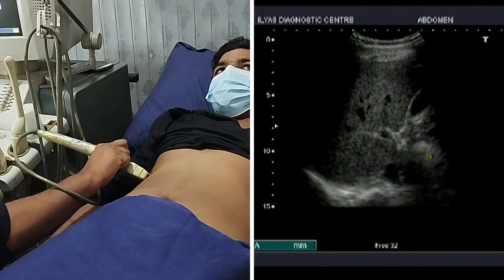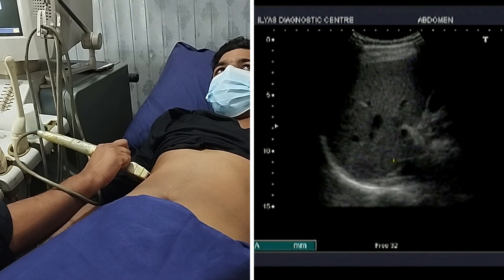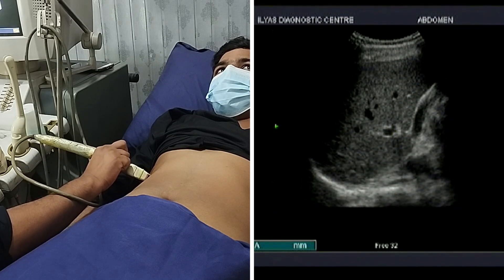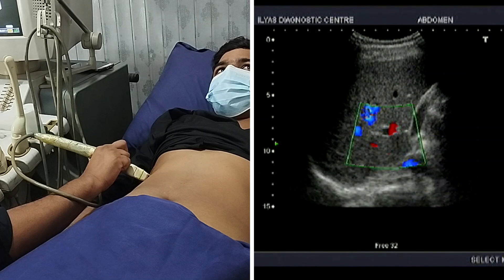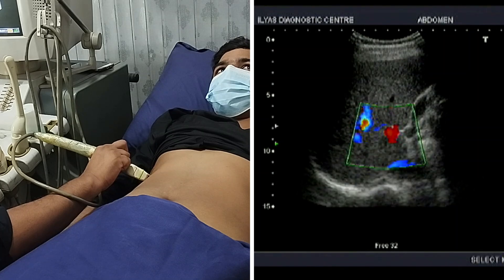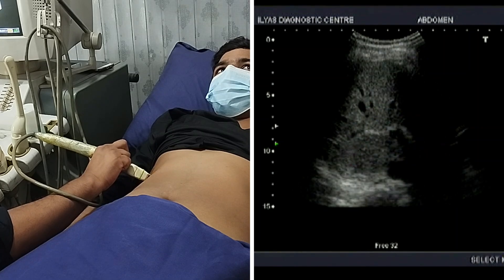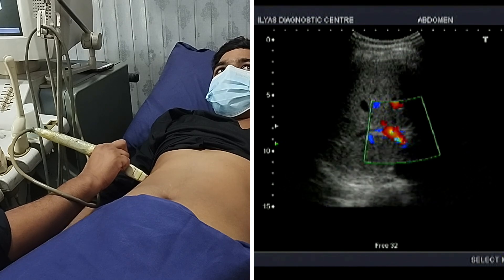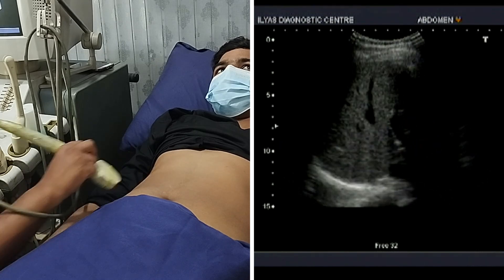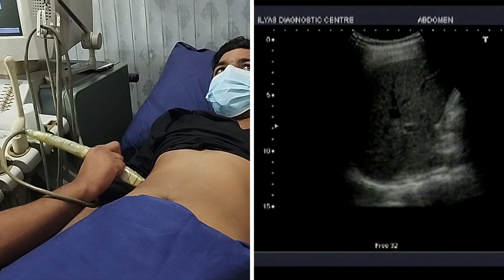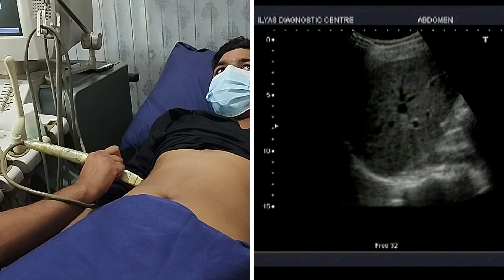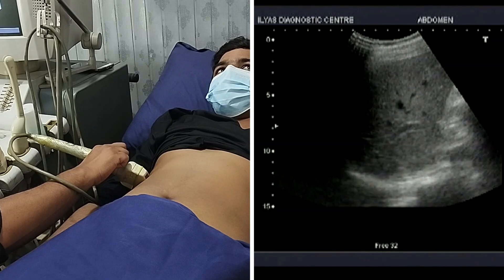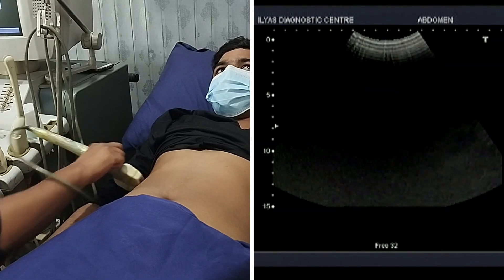I will completely evaluate the liver. Here is the portal vein — I will apply the Doppler to show you the flow in the portal vein. Here you can see blood flow in the portal vein. The right lobe of the liver is being visualized completely, and the gallbladder has also been seen.